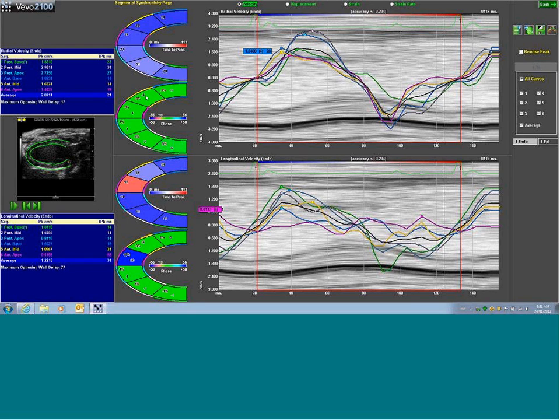And there's also underneath something called phase. So it's illustrating the phase of the heart. When phase is calculated, it looks at an average. So you can see this black line that's found throughout both graphs. That is the average taken between all regions of the heart. If the regions of the heart peak before this average, they'll be shown in negative values, as well as percent. If they peak after, they'll be illustrated in positive values.